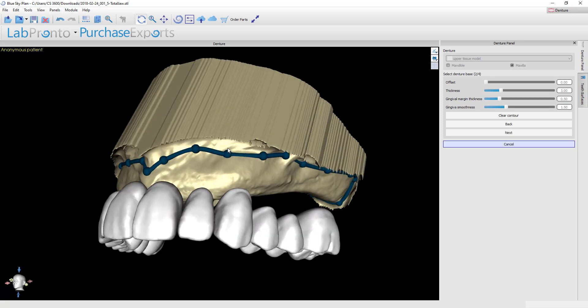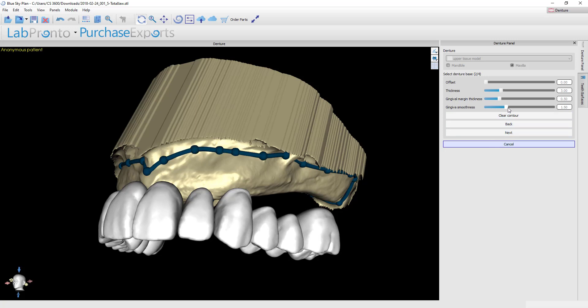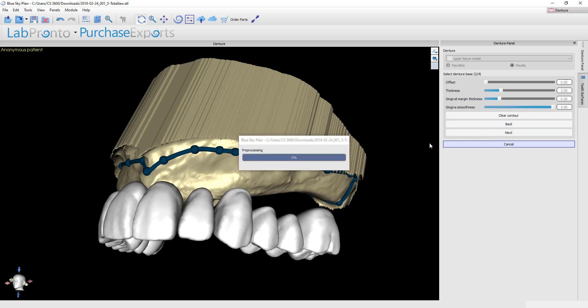If you need to add additional nodes, you can hold the shift key and drop additional points in. Make sure you're happy with your boundary. This time the change I'm going to make is I'm going to drag the gingival smoothness all the way up to the maximum and then click Next. Let's see how that affects the shape of the gingival proposal.